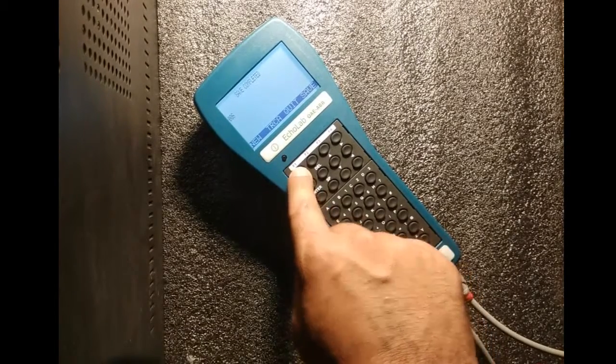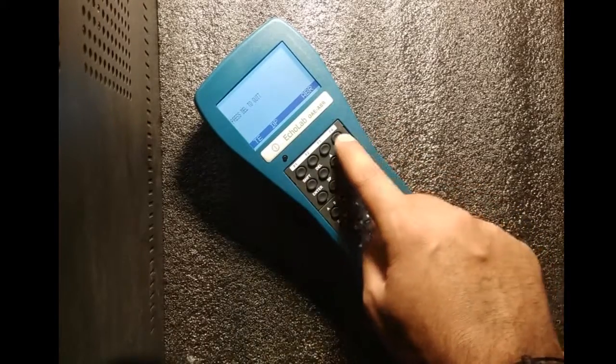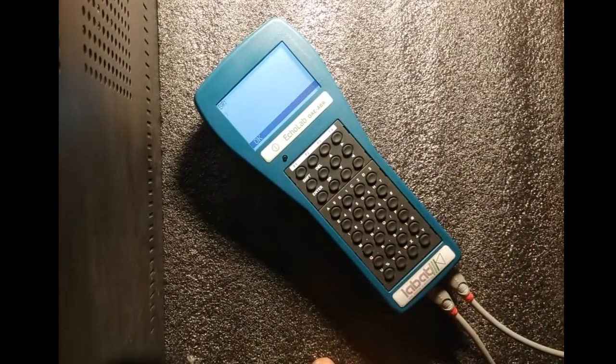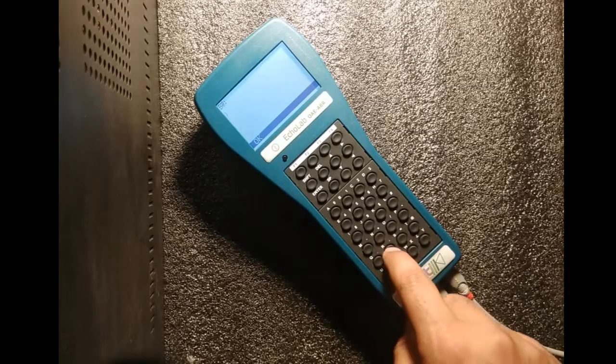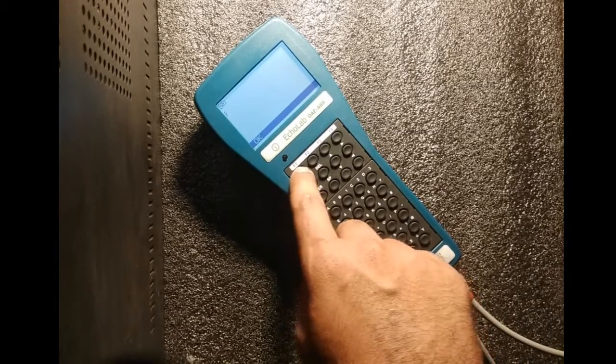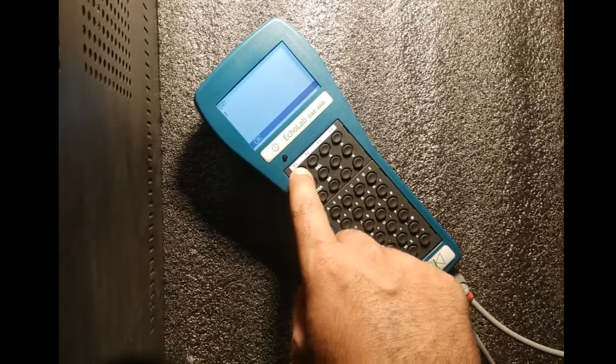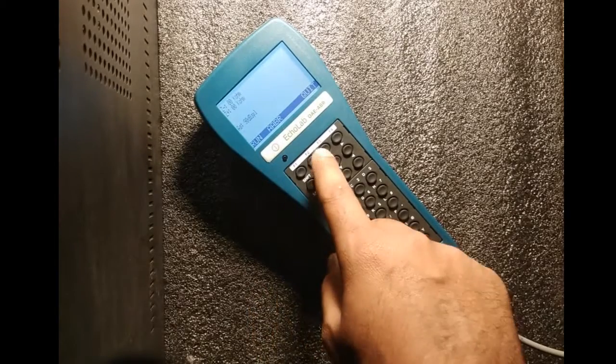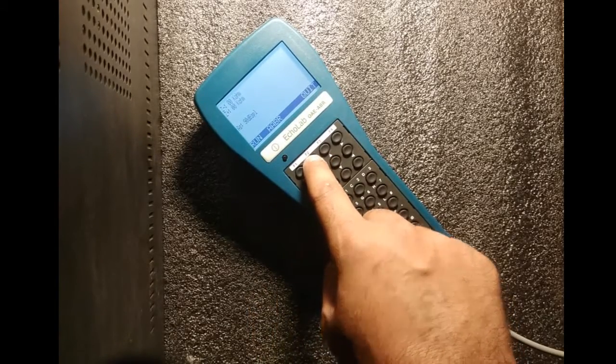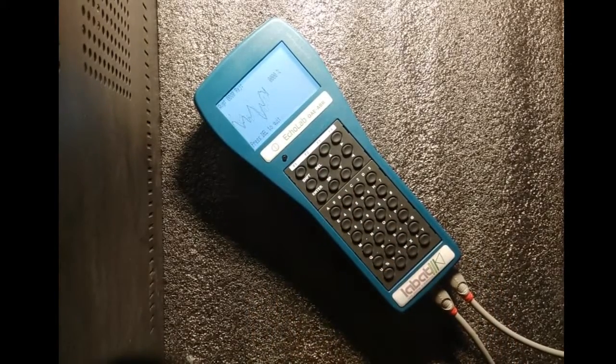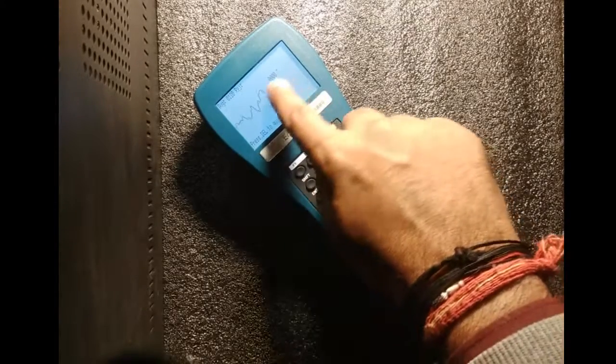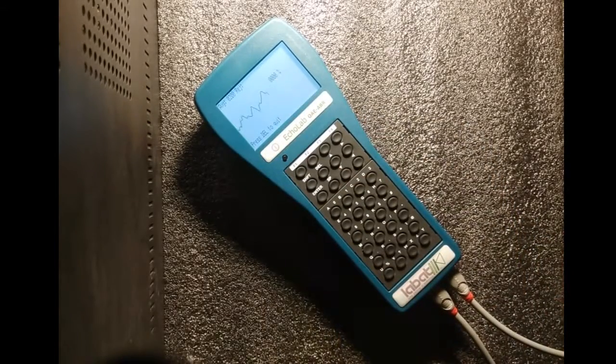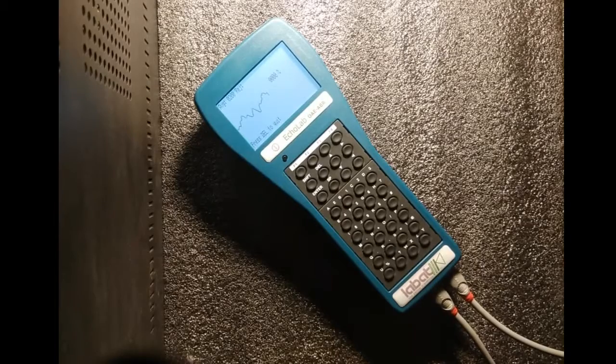Now if you want to do the ABR, we will hit new. We are in the test menu. After that, we will select F4 for ABR. You will select the test ear, which is right, as we have made the connection according to the right ear. Then F1, and now F2 for ABR. Now it's in process. You can see it is showing zero percent match, and it will increase as the test progresses.